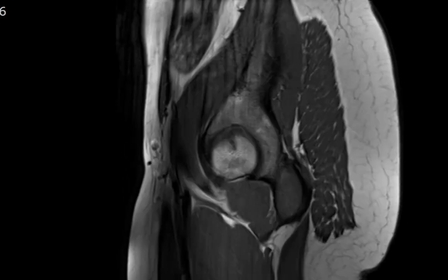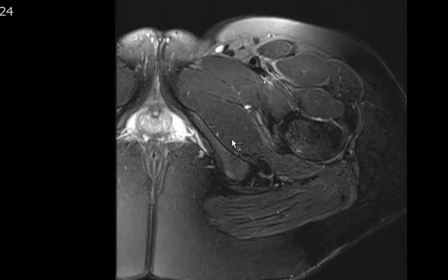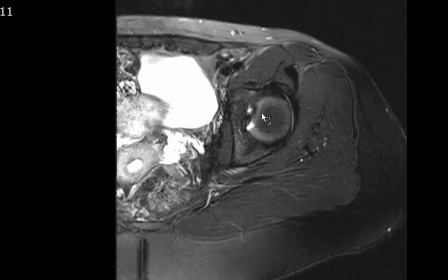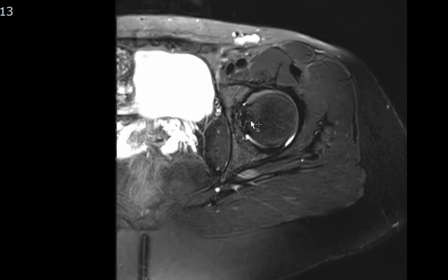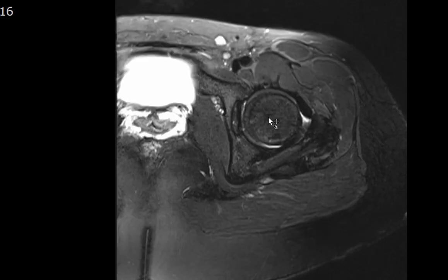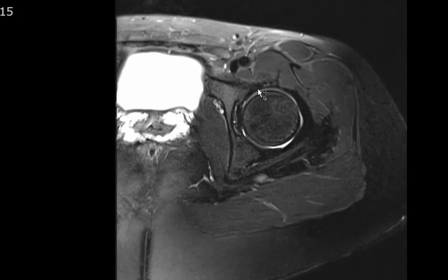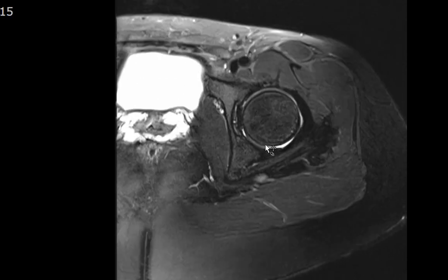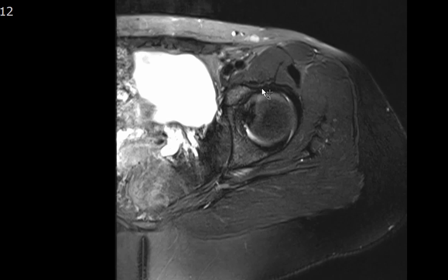On the axial T2 fat-saturated weighted images, the marrow is normal at the hip joint. This is the fovea capitis with the ligamentum teres inserting onto it. There's no joint effusion. The anterior and posterior labrum are identified — no T2 hyperintense signal within the labrum to suggest labral tearing. There are no paralabral cysts, which could be a clue to the diagnosis of a labral tear.